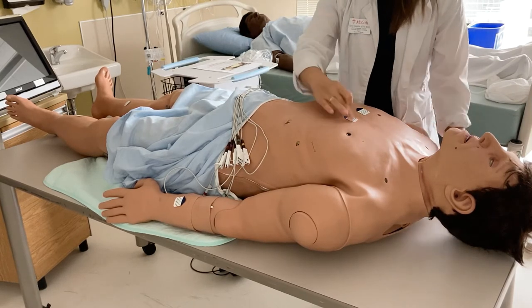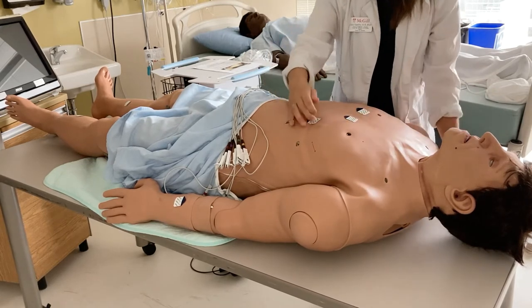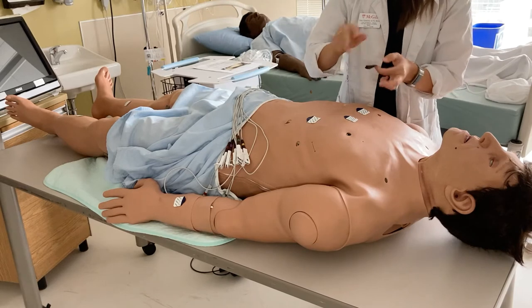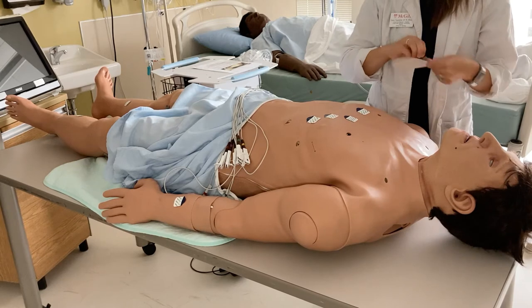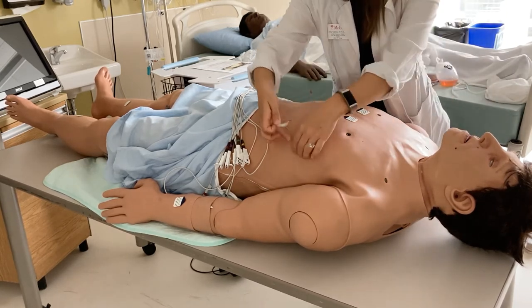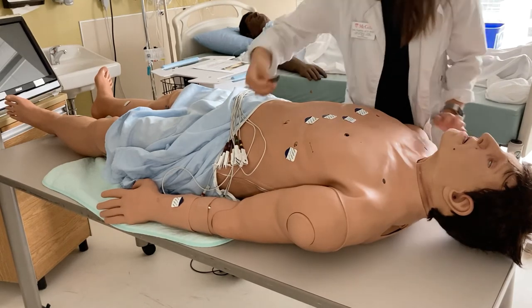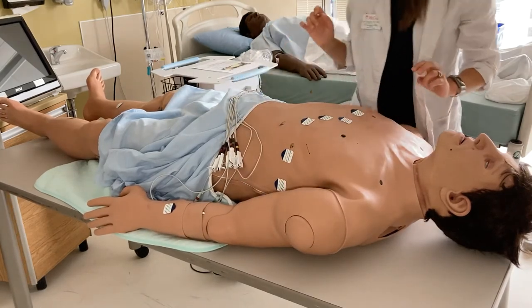Instead of placing V3 right away, I'm going to find the location for V4 first, because V4 goes in the fifth intercostal space on the midclavicular line. I will find the fifth intercostal space and the midclavicular line and place it there. V3 goes directly in between V2 and V4, so I will place it approximately in the middle. V5 stays in the fifth intercostal space and goes to the anterior axillary line, and finally V6 is still in the fifth intercostal space but at the mid-axillary line.